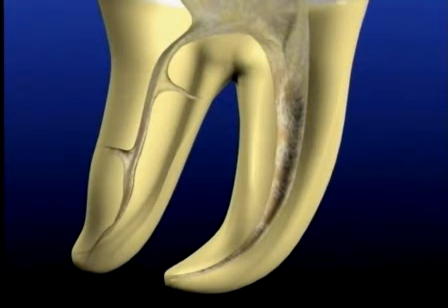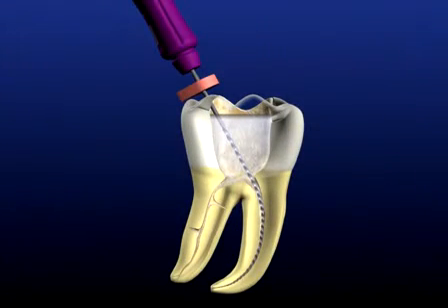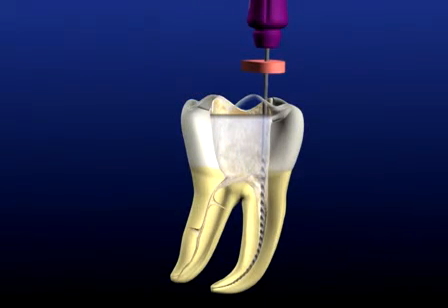Following the use of our first two shapers to length, it is wise to recall that working length will decrease as we've created a more direct path to the radiographic terminus. It would be wise then to reconfirm working length prior to finishing the root canal space.